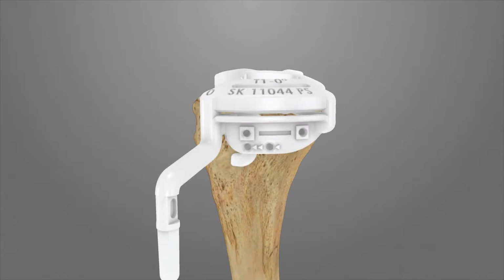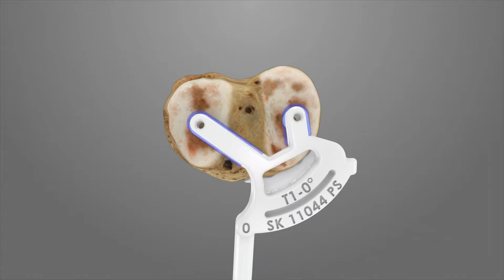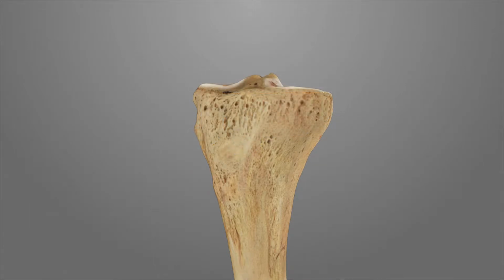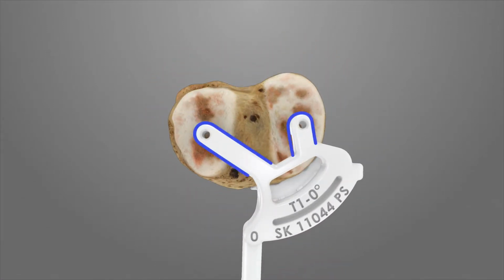Step 2. Tibial resection. The tibial resection iJig, T1, is designed to resect below the lowest point on the medial tibial plateau. The T1 iJig has two projections that match the subchondral bone surface of the proximal tibial plateau, and one projection on the distal portion of the T1 iJig that matches the subchondral bone surface on the anterior tibia. With the leg in flexion, place the T1 iJig onto the tibia and mark the boundaries of three projections with a surgical marker. Remove the T1 iJig.